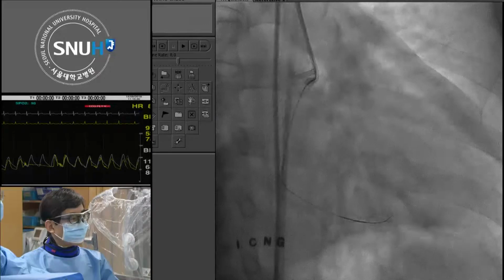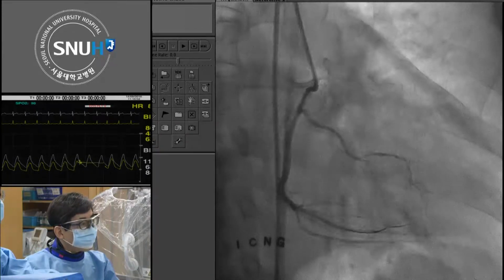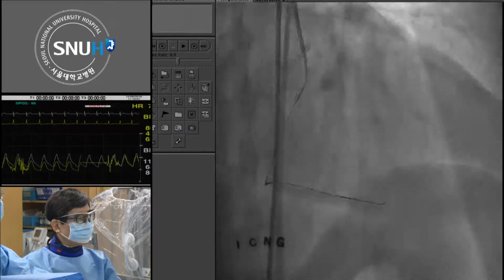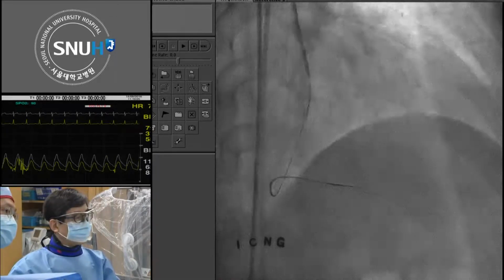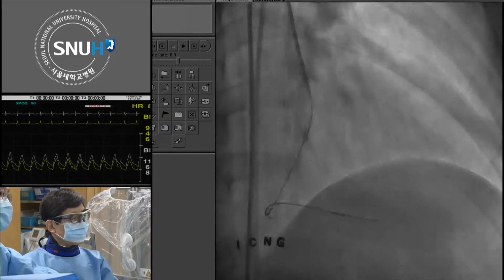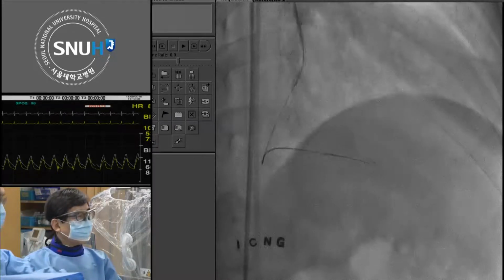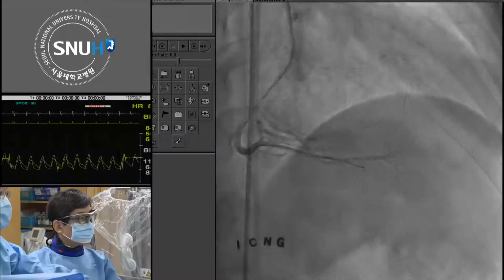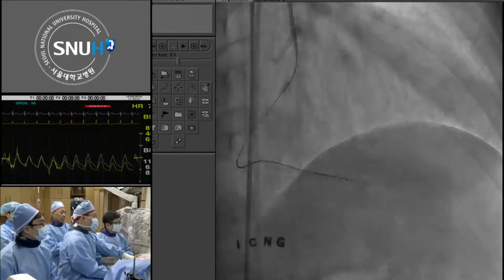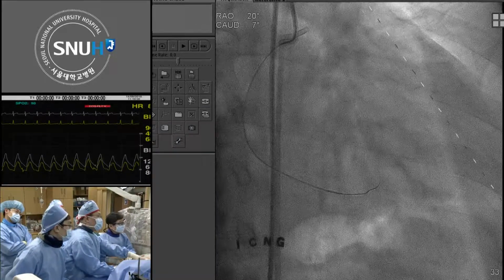Which wire do you use? Sion. Okay, a little bit cranial. Yes, I agree. What wire is that, Dr. Kim? Sion. Yeah, Sion.